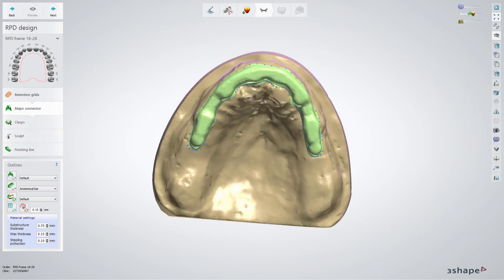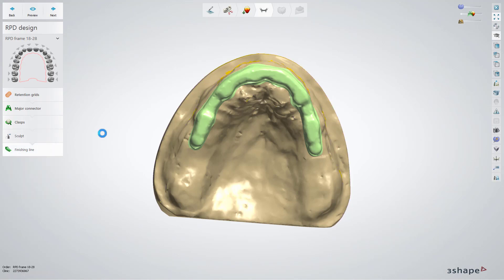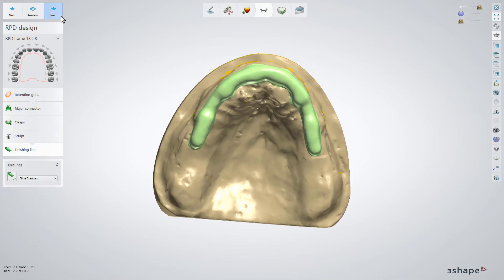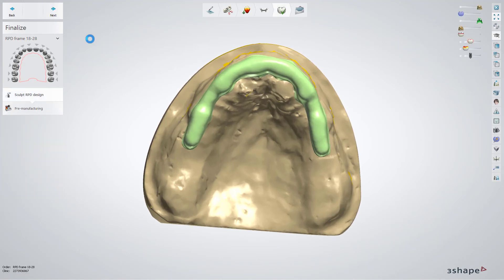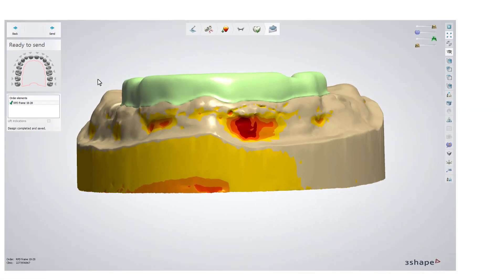Skip the further sub-steps and move to the finalized step. Use the Sculpt tools if needed. When your design is ready, move to the Save step. The design is saved and you can close it.